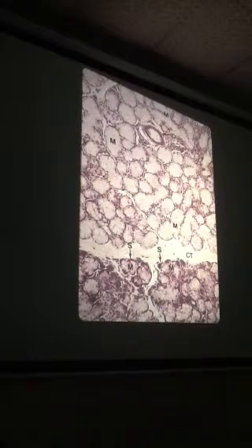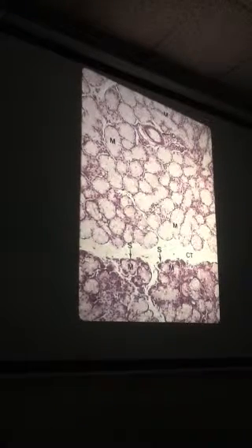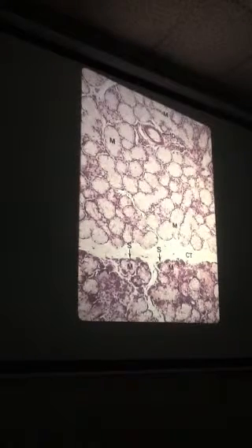I would greatly magnify those for any identification. So now you have your progression for next week. All serous is parotid, almost all serous with a little bit of mucus is submandibular, and then almost all mucus with a tiny bit of serous is sublingual. So if you have that in your mind, you'll have no problem identifying salivary gland tissue.